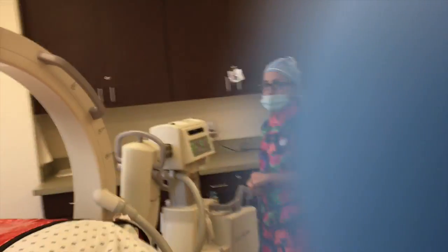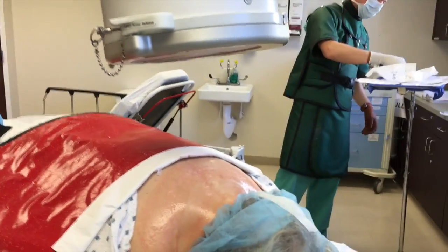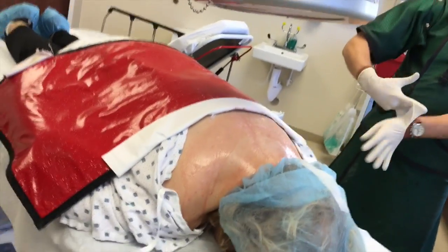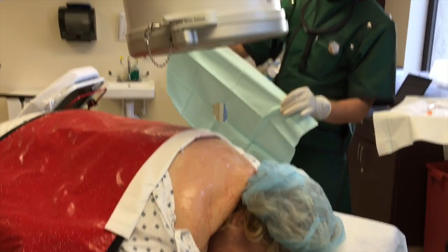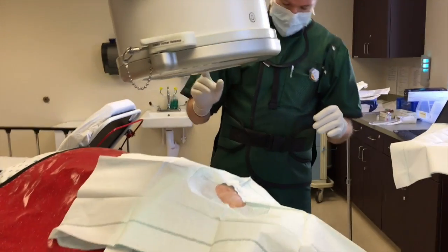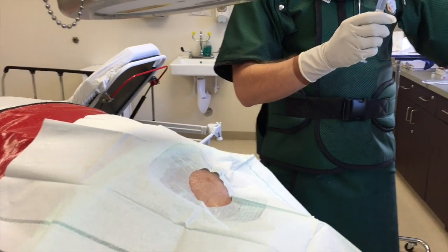This is a real-time cervical transforaminal epidural, both sides, bilateral. C4-5, bilateral. We do cervical epidurals very differently here than anywhere else in the nation, actually. We use a modification of the old technique. The old technique used a sharp needle — we don't. We use a blunt needle and we use a side port. The difference is we don't have to go inside the cervical spine, so the risk to the arteries inside the spine is very minimal.